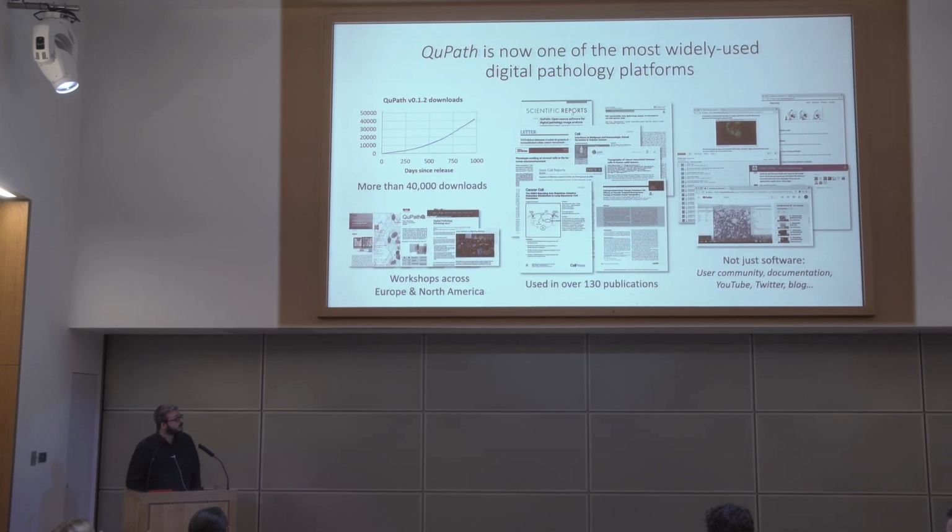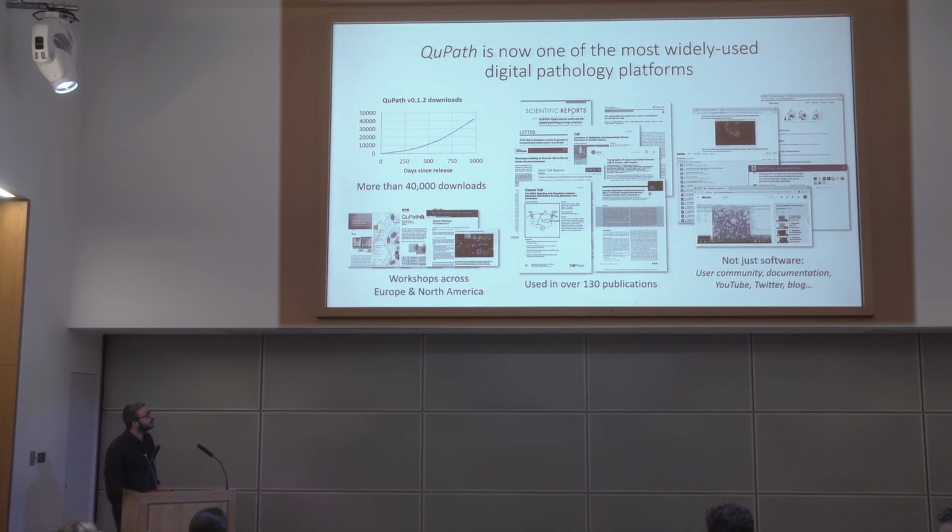But because it's open source, the last stable version was released on my last day at Queen's University as a postdoc. Since then, it's had more than 40,000 downloads. If you count some of the other versions since then, it's well over 50,000. And it started to be used really all over the world. I try and keep up with the publications that are using it. Please do cite it. It makes it easier for me to find.